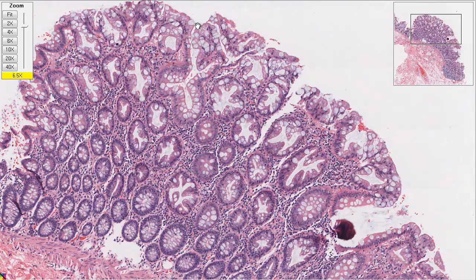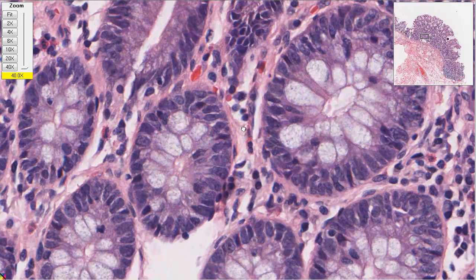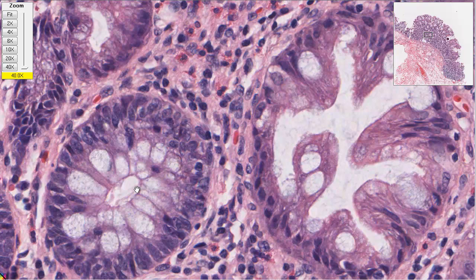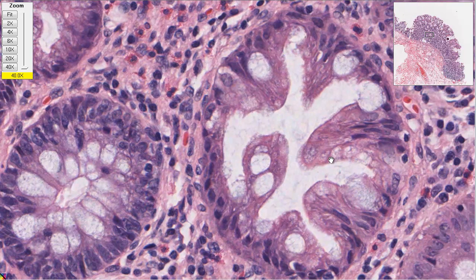Although when you come from the surface and go down, they normally should never branch. And so these ones are branching, and that's always bad. And then you can see the way, when you're looking at a cross section, there's normally just a little hole in the middle — that's where the mucin is, you can even see it spilling out there. This one here looks different. It's piled up. It's a little bit bigger around, and there are more cells — they're all piled up and going like this. And they even branch.